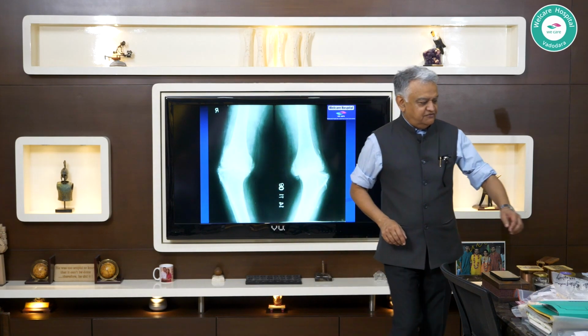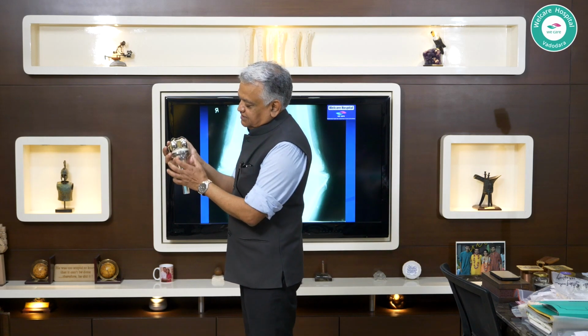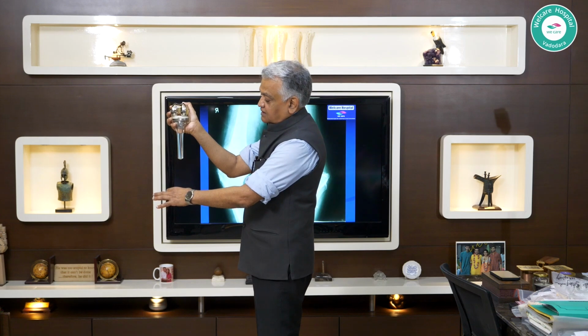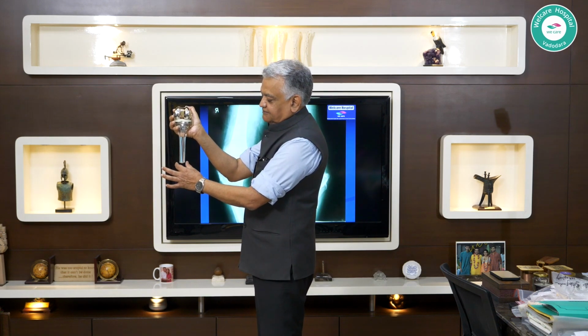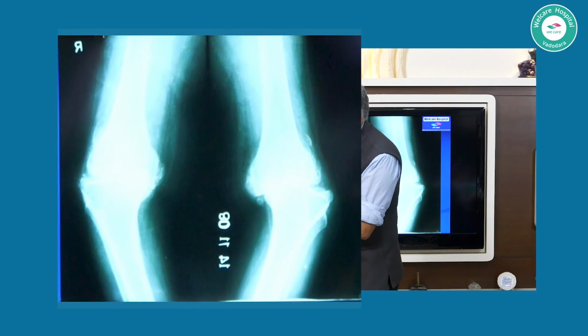So in other words, if I am putting my tibial jig here, cutting block here, and then the tibial jig on the ankle, all I have to do is to make sure that my tibial, and this is as far as the manual conventional instrument method is concerned. We will quickly refer to what happens during navigation. Robotics is nothing but a little bit of mechanical action added on to navigation. But we will come to navigation in a moment. First, let's use the mind's navigation, which is quite adequate.